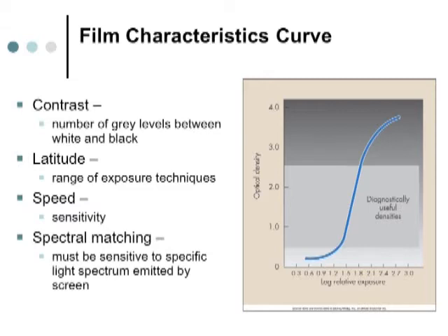How much room for error do we have? Now with cardboard cassettes, when I said that the film is not very sensitive to radiation, you could use 500 mAs or 100 mAs and basically get the same scale of contrast on your film, as long as you have the right kVp. With a rare earth system, if I use 1.5 mAs or 2.5 mAs, that's almost the difference between too light or too dark.